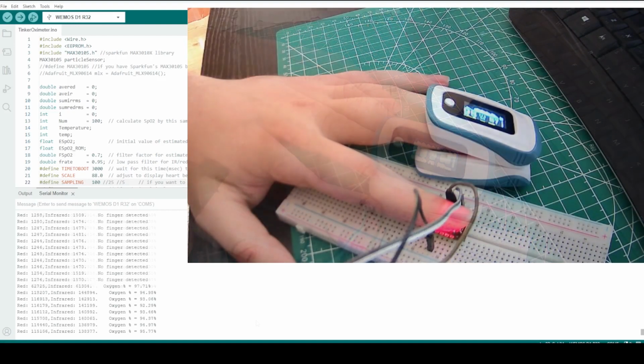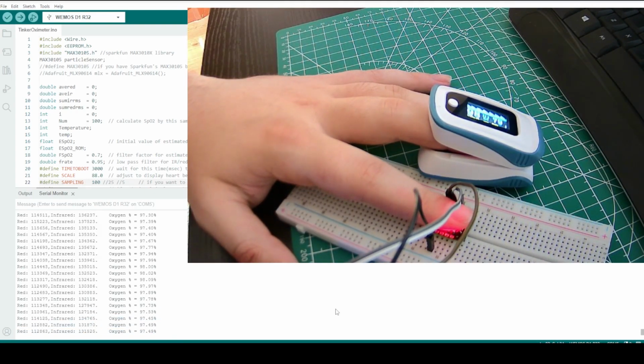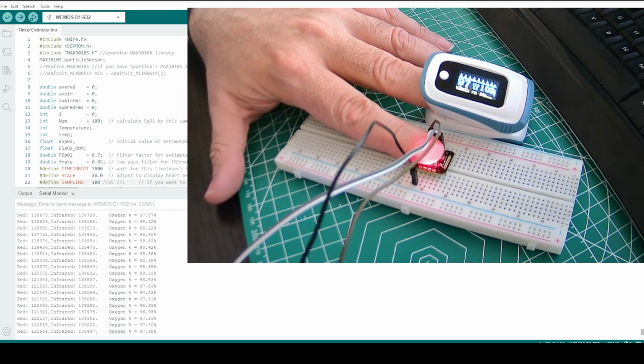I've tried it out on different people in the vicinity of the Tinker Foundry with similarly good results. I even tried hyperventilating to affect my own blood oxygen saturation levels so I could get readings different from my baseline. You can see it reaches 99% in both my reference device and with our ESP32-based solution.